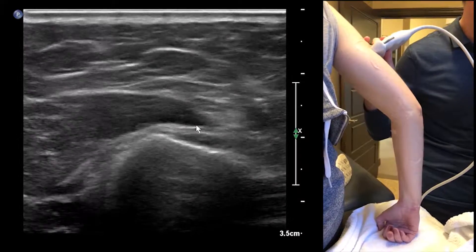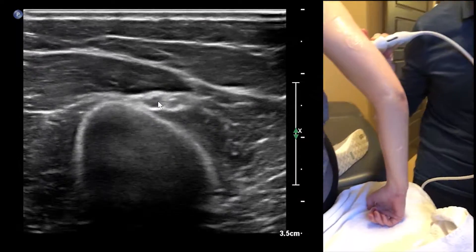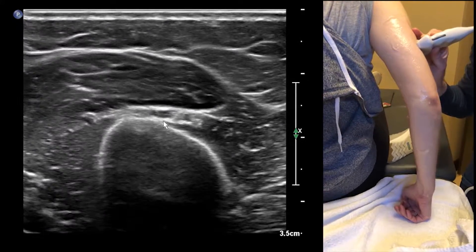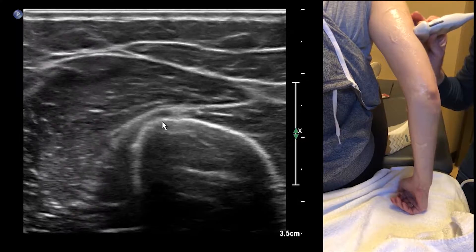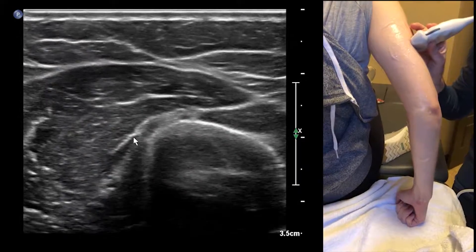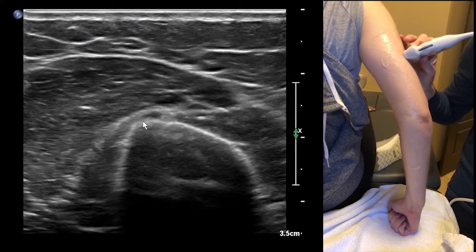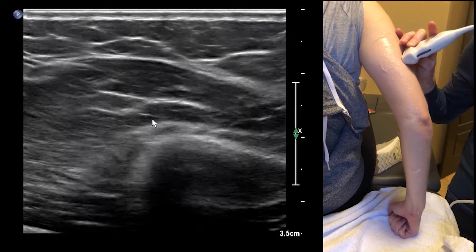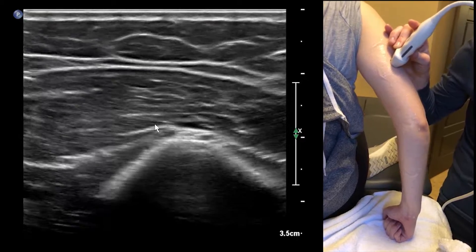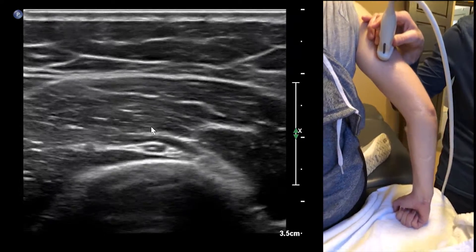It's going to come around the humerus — I'll start right here and then we're going to follow it. You're going to notice that when you start scanning superior, it's going to drift to the left of the screen and it's going to become oblique. So when you have something that's drifting left, we're going to rotate our transducer, wag it, and follow it around — rotate and wag.